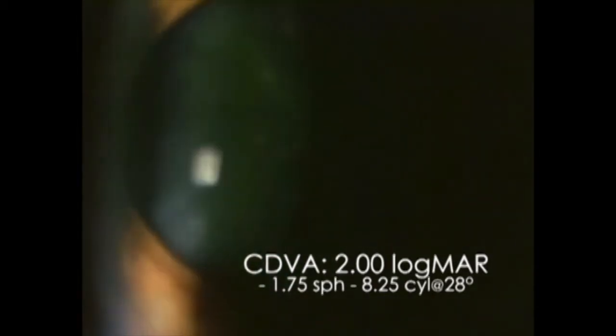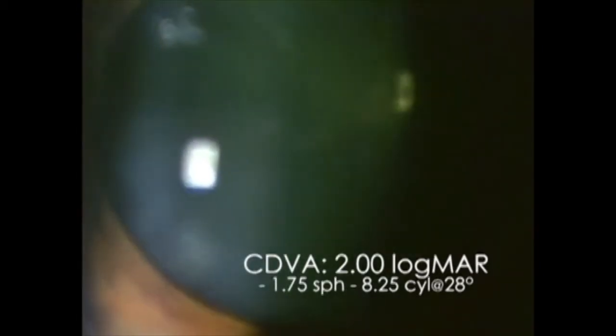In this video, we will present a case report where strategies to address irregular astigmatism correction were used on a keratoconus patient with cataract. The patient is a 63-year-old white female who presented complaining of decreased visual acuity on her right eye for the past 2 years. CDVA was 2.00 logMAR with the refraction on the screen. On the left eye, CDVA was 0.10 logMAR with a refraction of -3 sphere, -0.5 diopter cylinder axis 180.